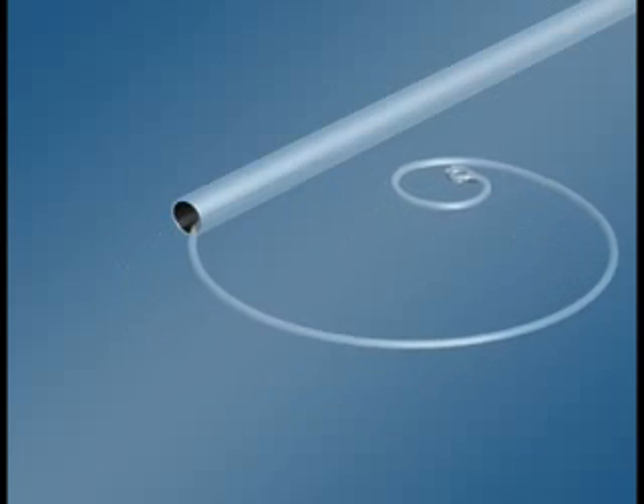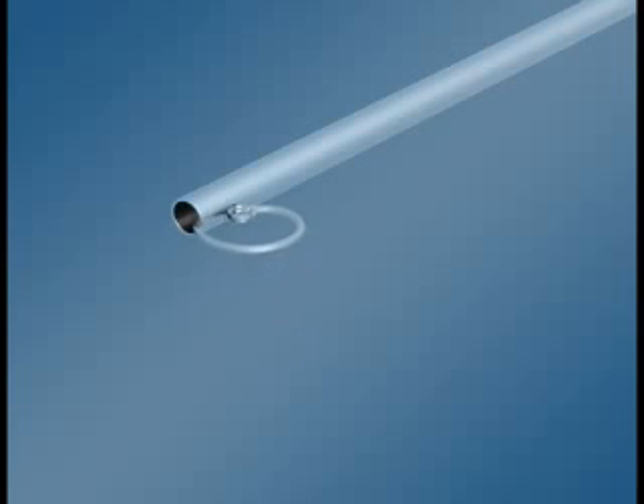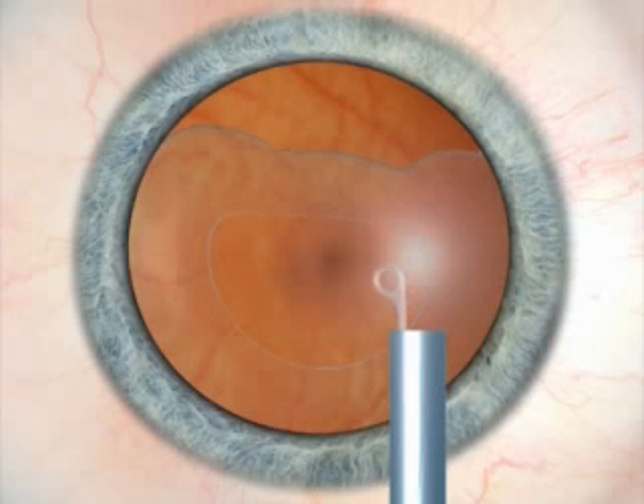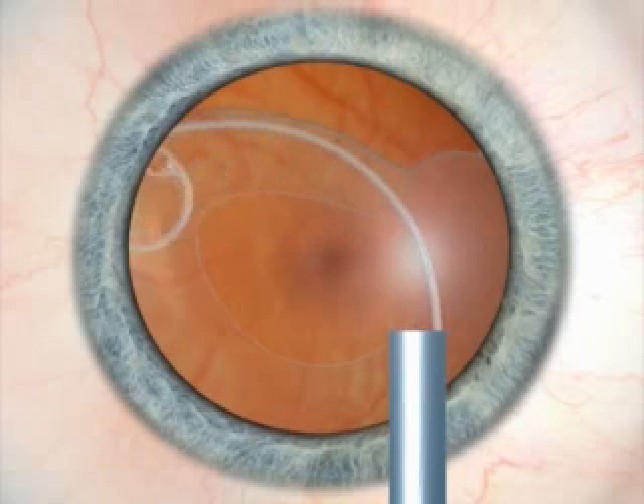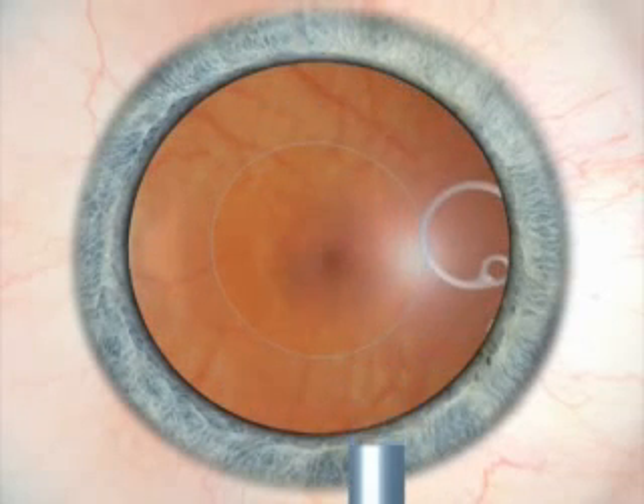The Malugin-modified Cionni CTR is the newest endocapsular support device developed to address the difficulties of micro-incisional cataract surgery in patients with large zonular dialysis or zonular weakness. The fixation element moved to the tip of the device allows its positioning inside the injector tube. The hook of the modified CTR is directed towards the zonular defect in order to prevent unzipping the residual zonules during implantation.